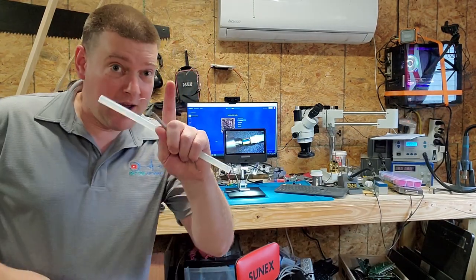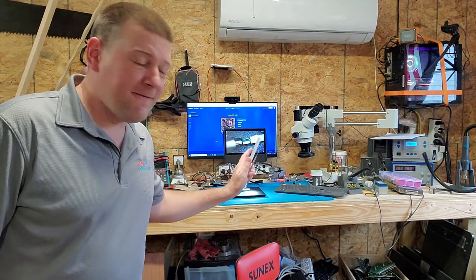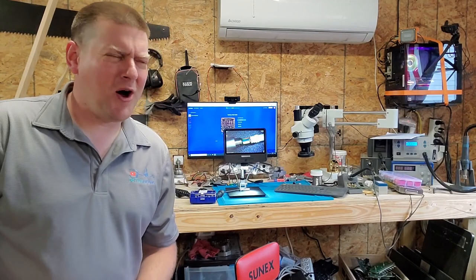Hey guys, welcome back to Better Biomed. Today I'm going to show you guys how to fix some of these cables up close and personal, and I got a brand new tool that's going to help me out today.